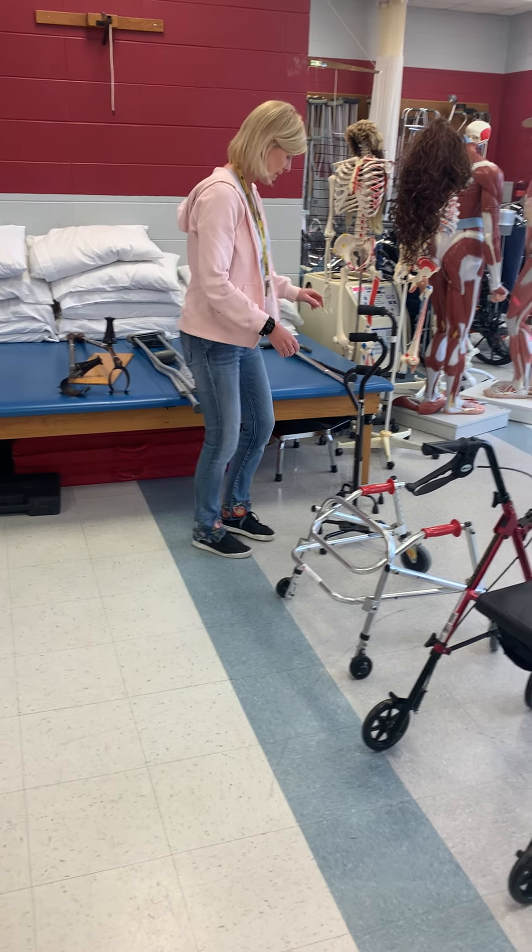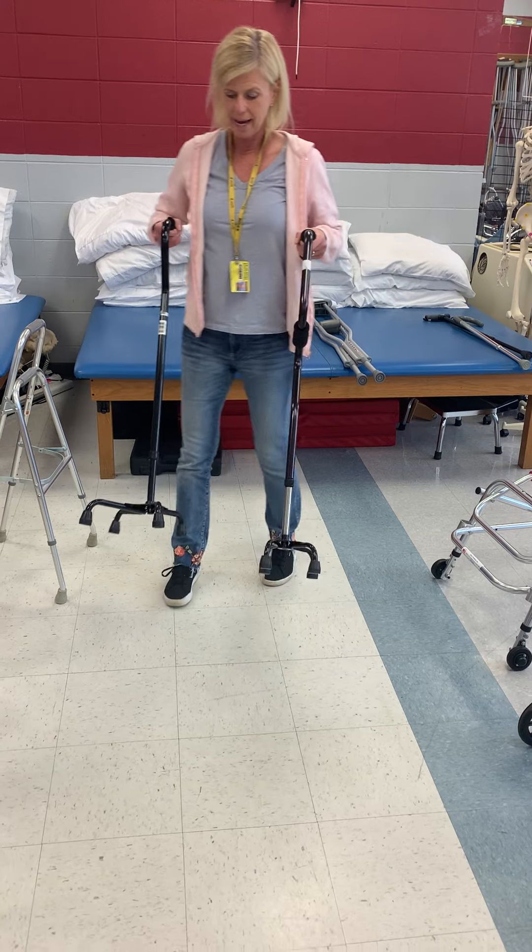Now we're going to go to canes. These are called quad canes.